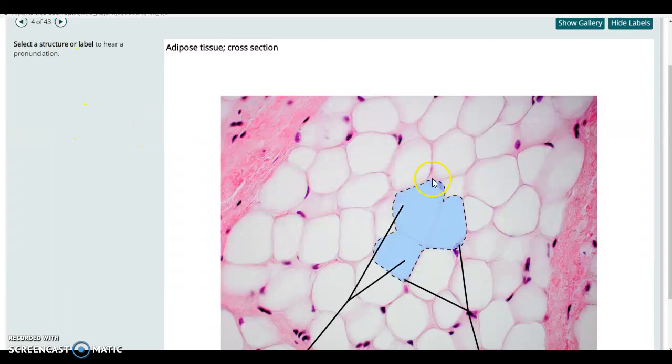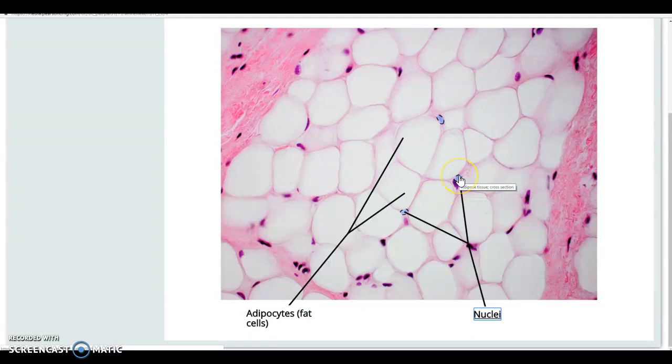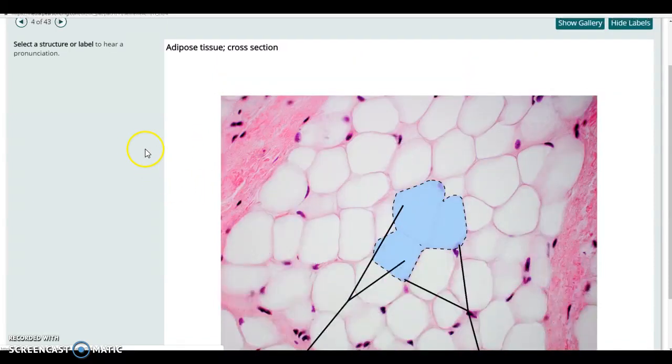This is a view of the fat cells just closer up. Again, the big fat cells that you can see there, there you can see a couple of their nuclei on the surface, and there you can see some of those nice collagen fibers that wind through the tissue and that the cells are situated on, the reticular fibers made out of collagen.